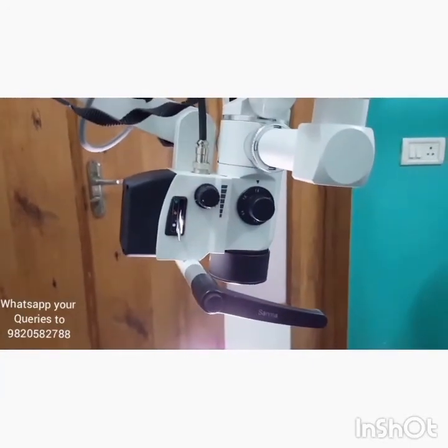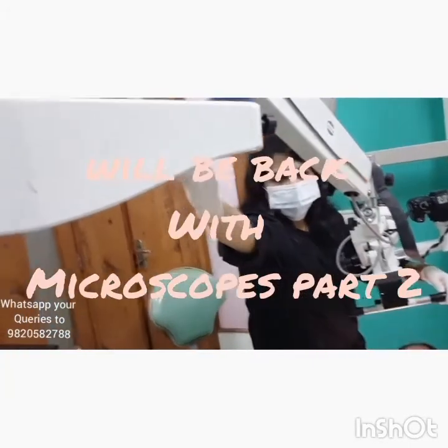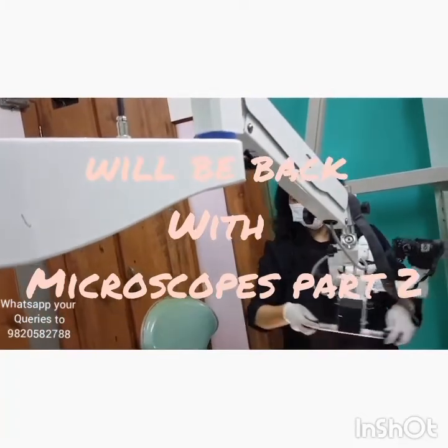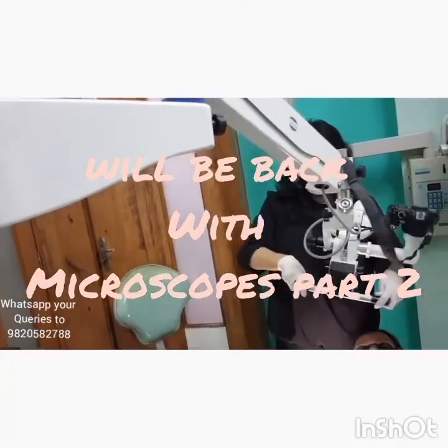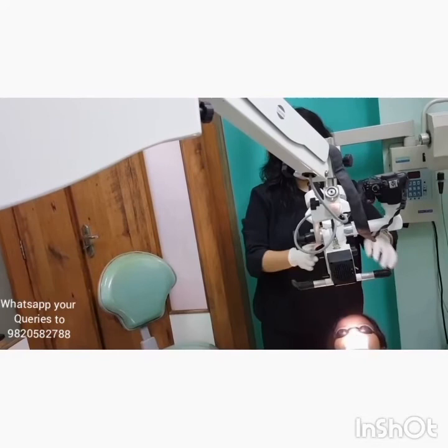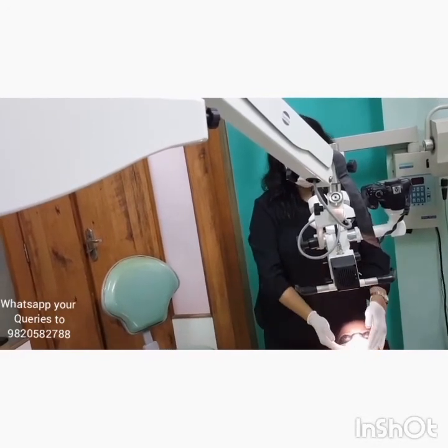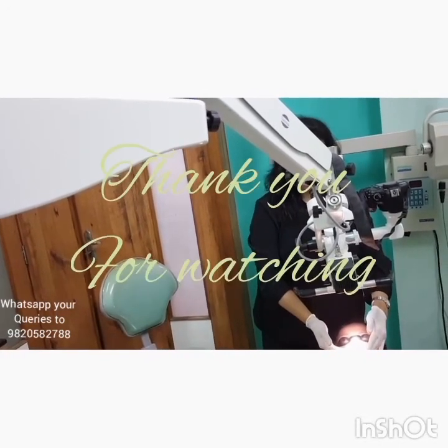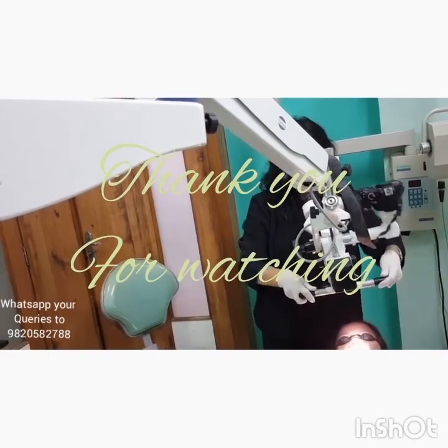The movement of the horizontal arm and the swivel arm, as well as the tilt in the body of the microscope, helps in adjusting the microscope to give better visibility in any part of the oral cavity.